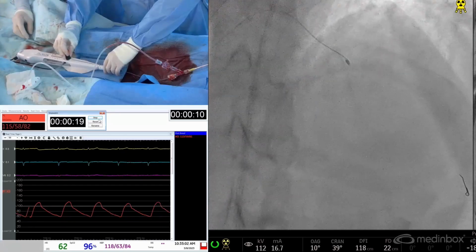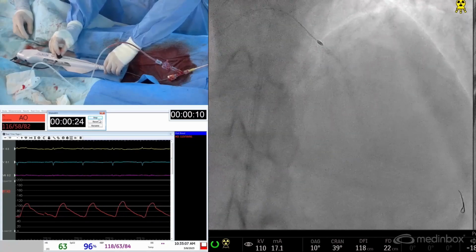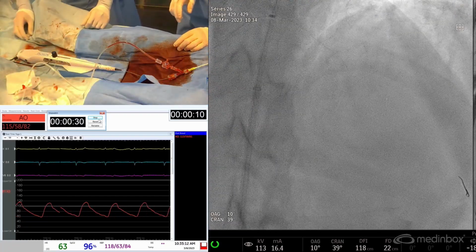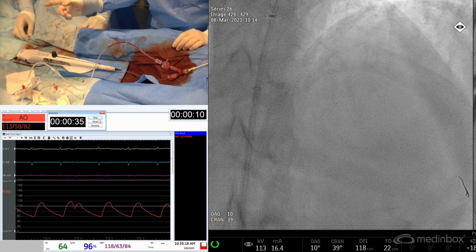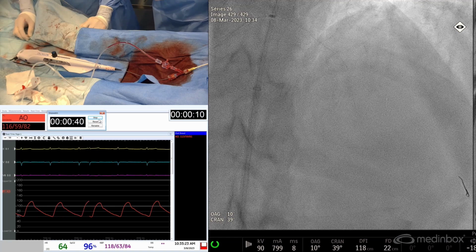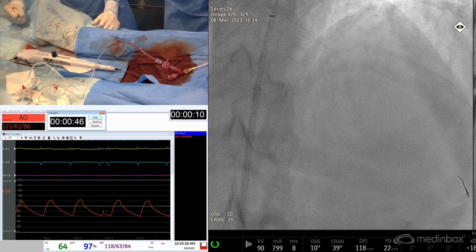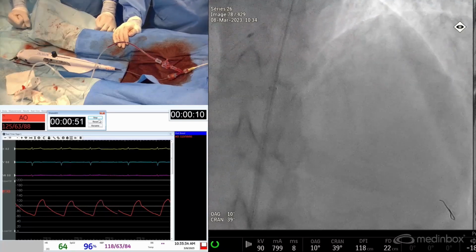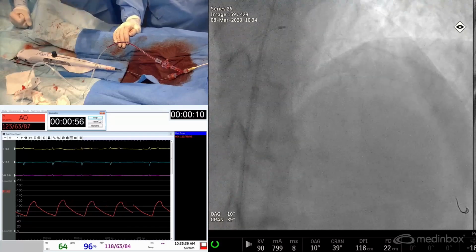Okay, stop there. You heard some tonal decelerations, and I'm not sure how low it went. 163, so not too bad. A 20,000 RPM drop. If some of us prefer to start with a low speed, which is more typical, you might have gotten closer to the range of 130, where you will definitely be closer to the Dynaglide, and then the risk of burr stalling. So that's our preference to go with 180.